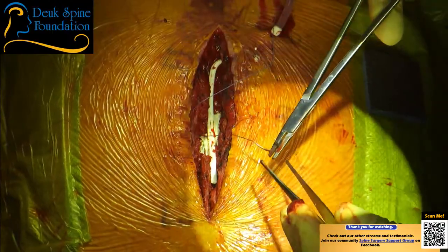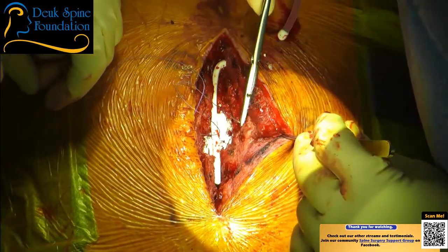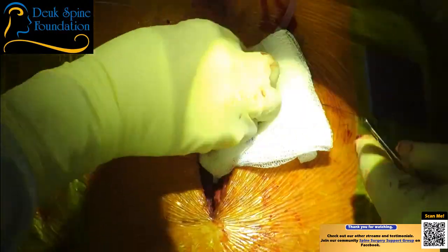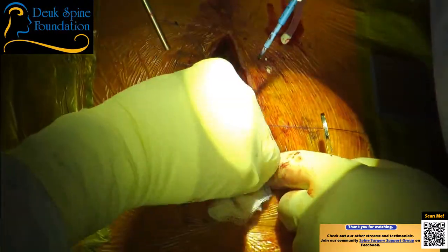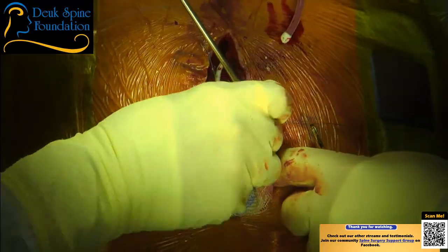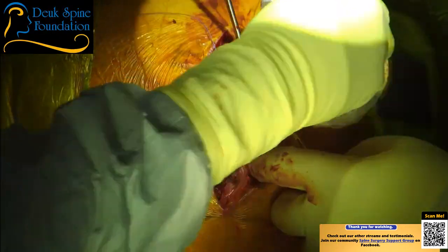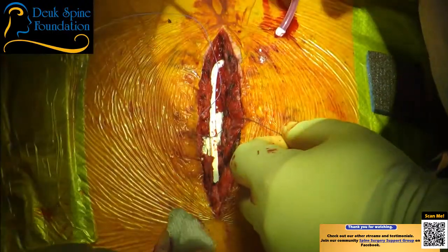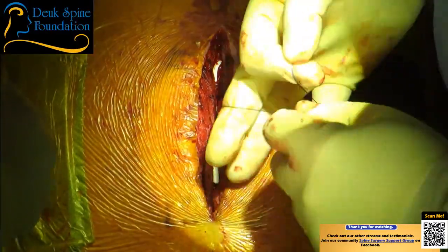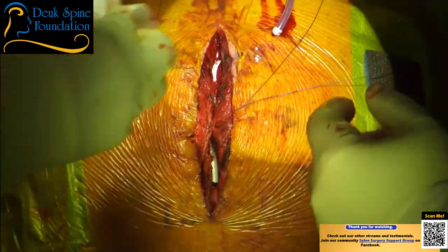Stick around for a little bit to help me. I may need some help with the hemostasis. Look at that. Oh, by the way, for those of you who don't know, these surgeries are all broadcast live. So you get to see, as the viewer, everything. Have you gotten a reading yet? Yeah, it's gone up. We're getting pop-up. I'm telling you, anything over 100, you're going to get spontaneous bleeding. We can't have that. You've got to get it down.